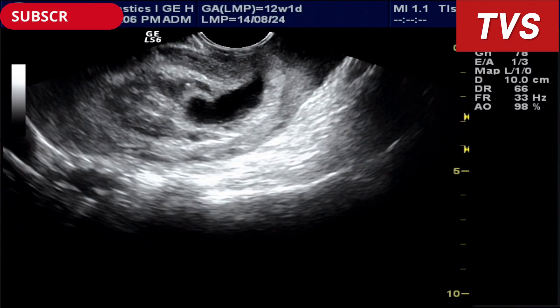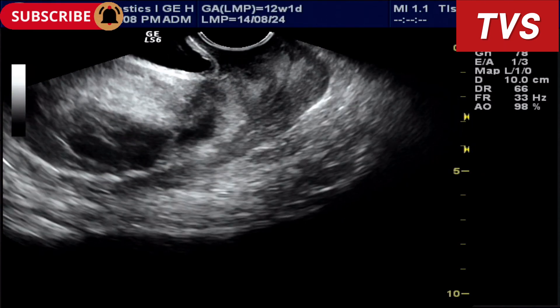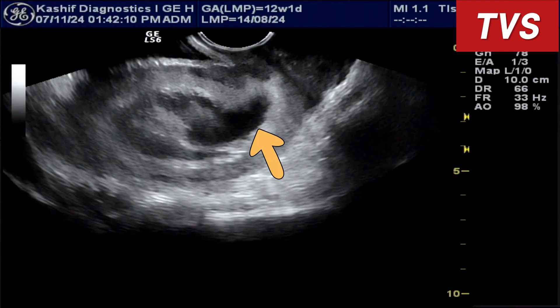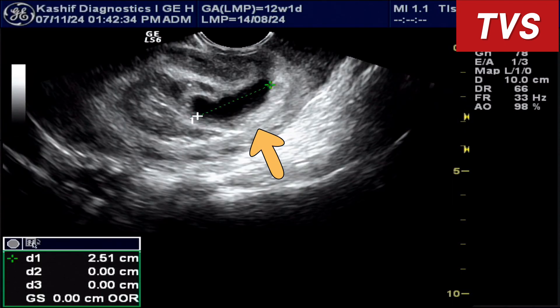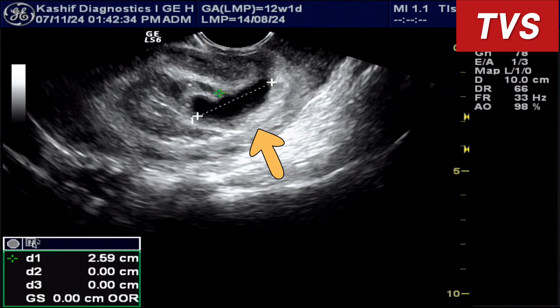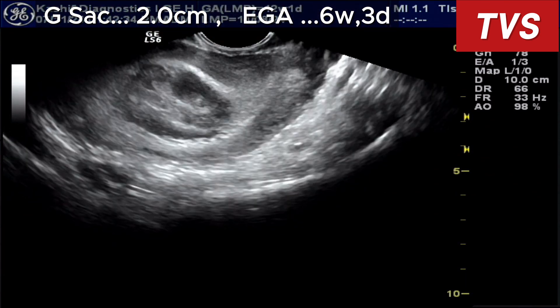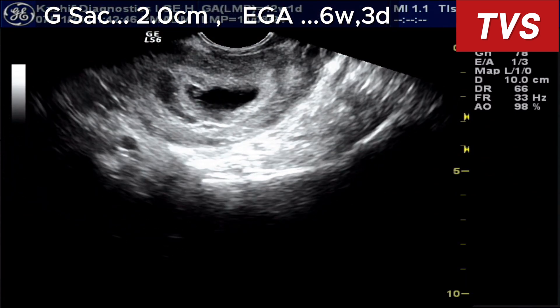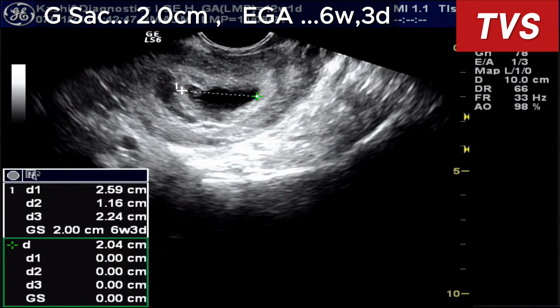An elongated gestational sac is seen in the mid-uterine segment. The gestational sac size is 2.0 cm, which corresponds to approximately 6 weeks and 3 days of gestational age.